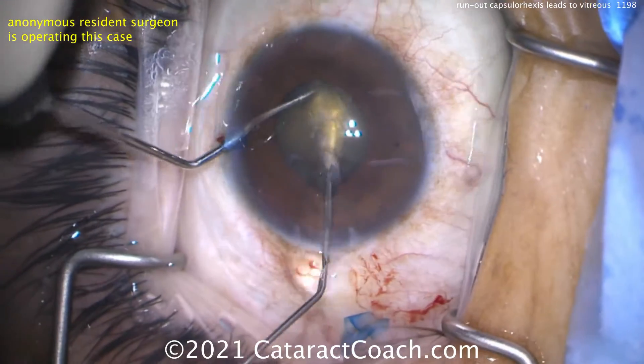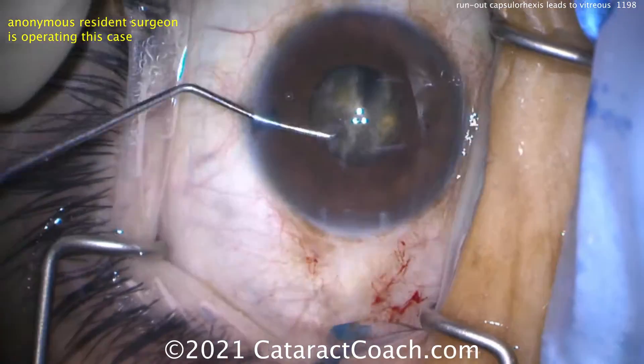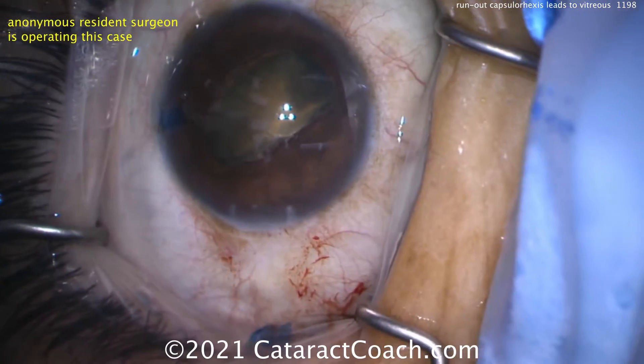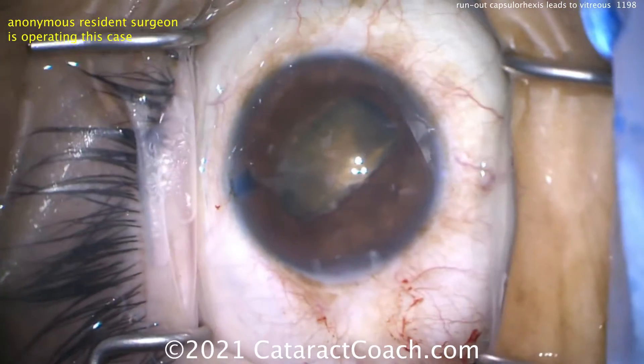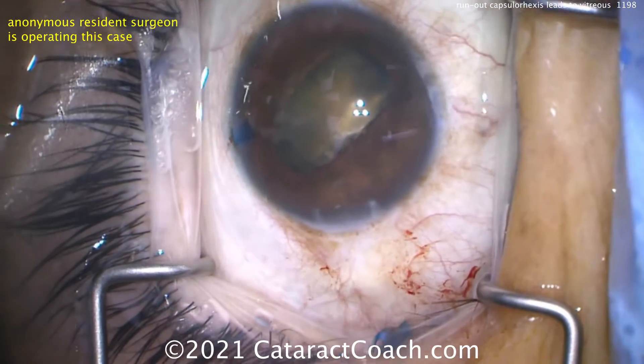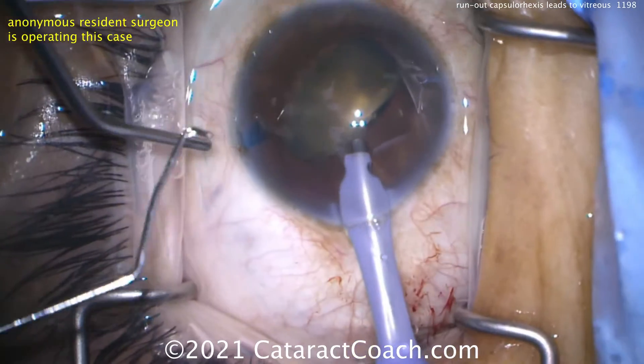Let's help the resident by breaking this nucleus in the bag — just chop it with a cannula and a chopper. Now you've got two halves in the bag, which should make it a lot easier. Let's mobilize these pieces and bring them up, setting it up for the resident to have a more successful procedure. Now taking the phaco probe to multiply the pieces.